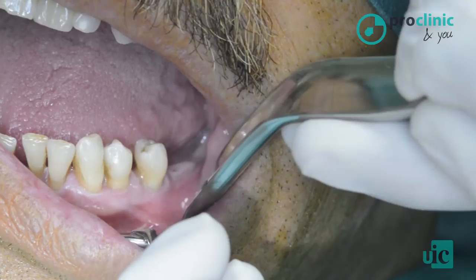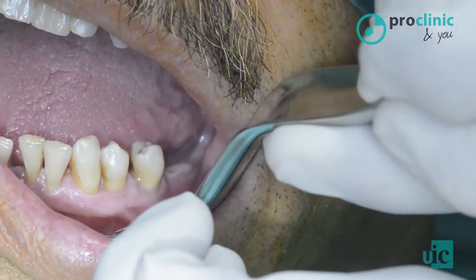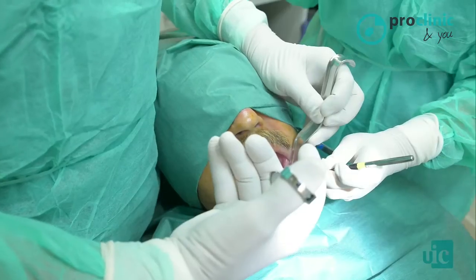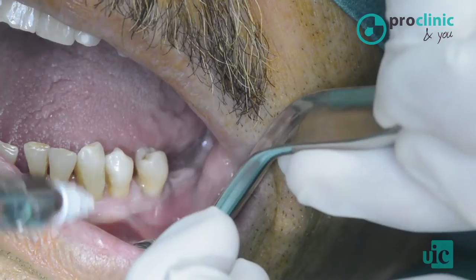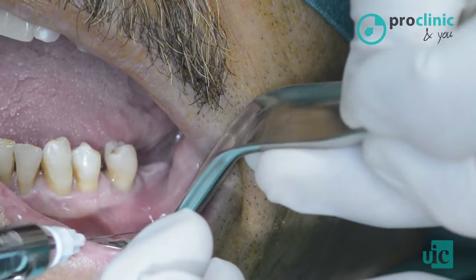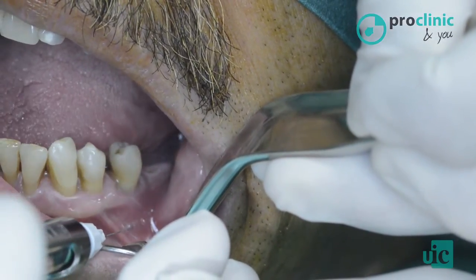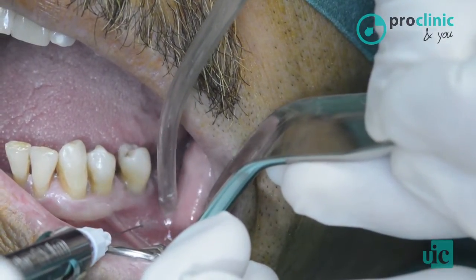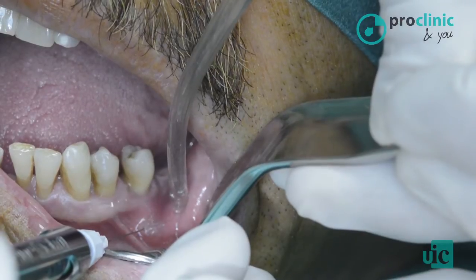To perform this infiltrative anesthesia, we tense the lip and the vestibule to enable the needle to penetrate easily and gently. We need to localize the tooth apex area. Then we tense the lip and vestibule and we start the anesthetic infiltration. A light aspiration should be done to check if we have penetrated a blood vessel. If not, we can infiltrate the local anesthetic slowly.